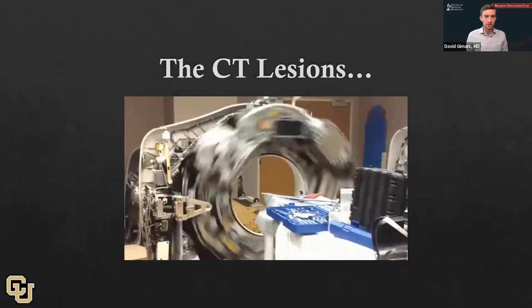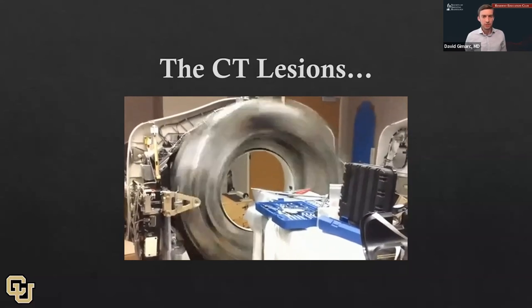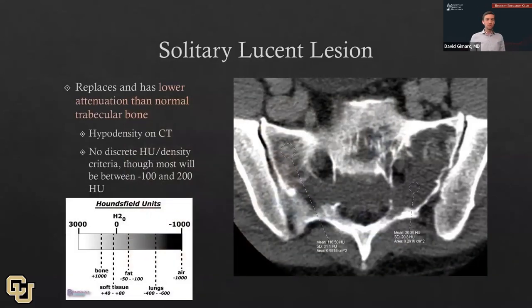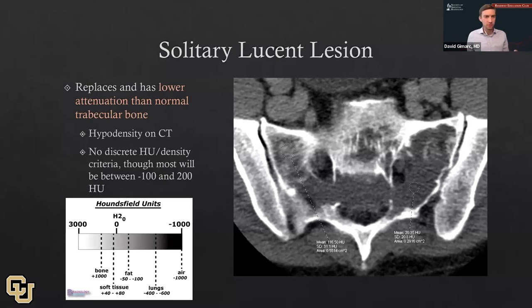We'll start with CT lesions and the solitary lucent lesion. I use 'lucent' rather than 'lytic' — I view lytic as a more aggressive way to say what I think lucent is: a lesion with lower attenuation than normal trabecular bone. Here in the sacrum, we see a lucent lesion crossing transversely with an ROI measuring about 20 Hounsfield units, compared to normal trabecular bone at about 115. These are hypodense lesions. The paper doesn't describe discrete Hounsfield unit criteria, but most of these lesions will fall between negative 100 and positive 200 Hounsfield units — that's fat density and some soft tissue and fluid densities.